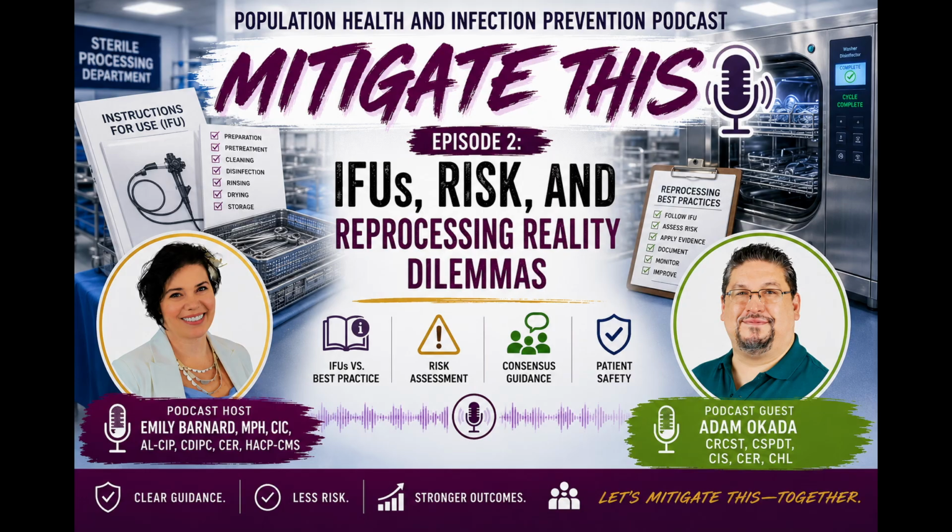And don't put step by step or specific products in them. I've seen hospitals get cited because they had put a specific pre-cleaning treatment in their policy, and they should not have done that, because then they changed over to a new manufacturer and got hit on not following their own policy. So that's something you've got to review.